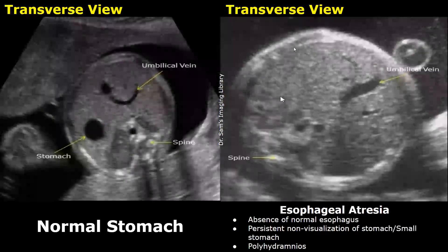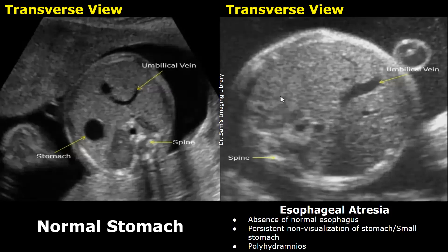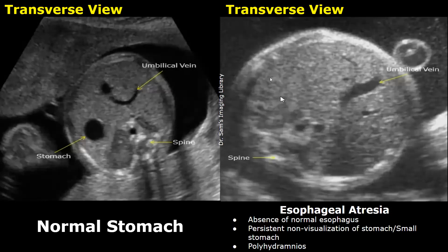In esophageal atresia there is absence of a normal esophagus. On ultrasound there will be persistent non-visualization of the stomach, or a small stomach is seen with associated polyhydramnios — which is an abnormally increased amount of amniotic fluid. Normally the stomach appears as a rounded anechoic structure, but in this image we do not see the stomach. The constant non-visualization of the stomach with polyhydramnios is a sign of esophageal atresia.